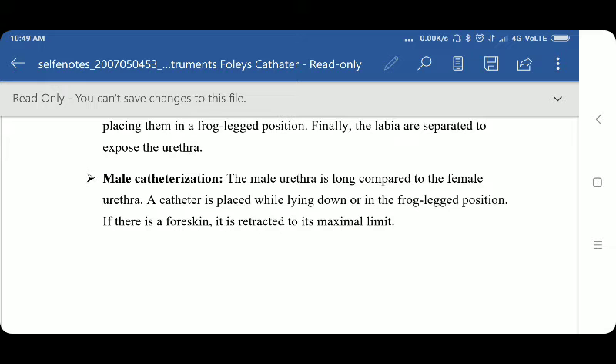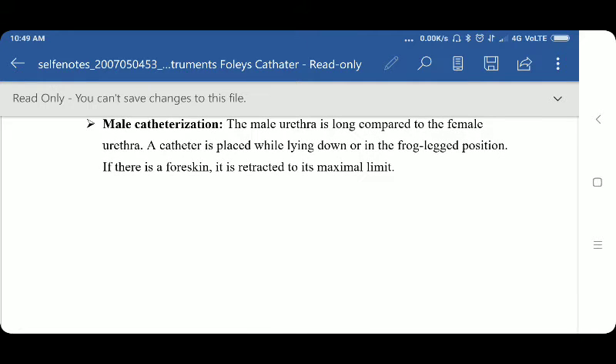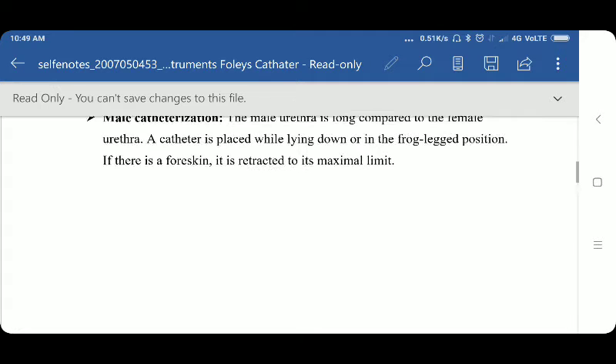Next is male catheterization. Here we are discussing the basic procedure. The male urethra is long compared to the female urethra. A catheter is placed while the patient is lying down or in the frog-leg position. If there is a foreskin, it is retracted to its maximum extent.